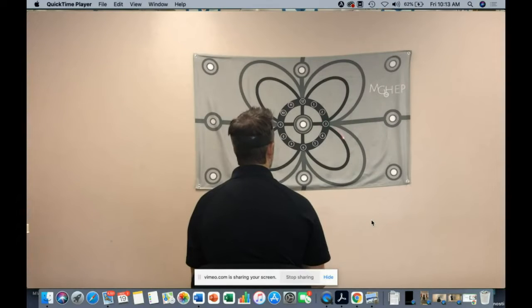So this is more cerebellar in nature versus ocular motor reflex, because the eyes and the head are following through the same plane. If this was very dysfunctional, there's different things that we can look at here. So you can look at precision, and not only precision on the line, but precision in hemispheres. So above the line or below the line might tell you more temporal versus parietal involvement. Right versus left side, so a cerebellar being an ipsilateral decompensation might tell you if there's a right versus a left side issue working around this type of target.